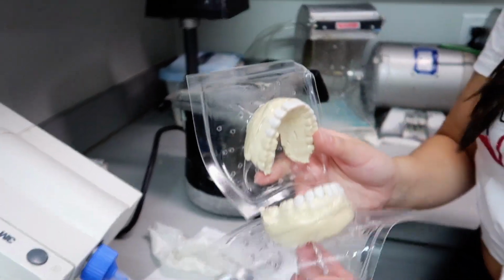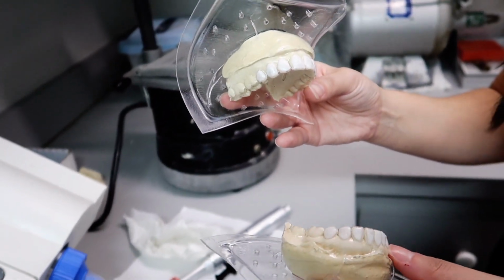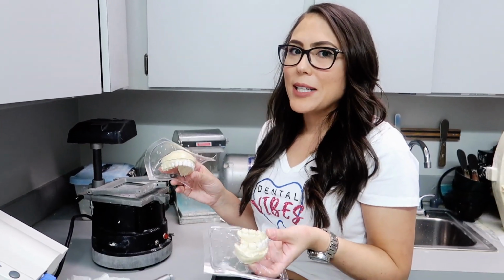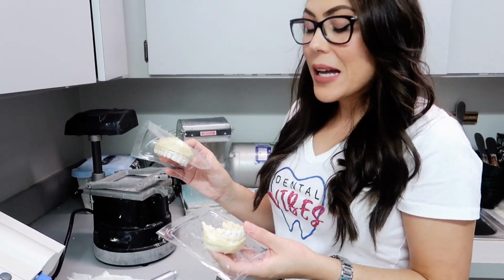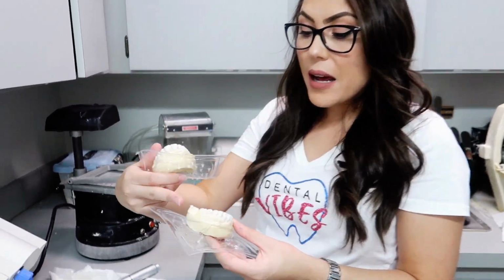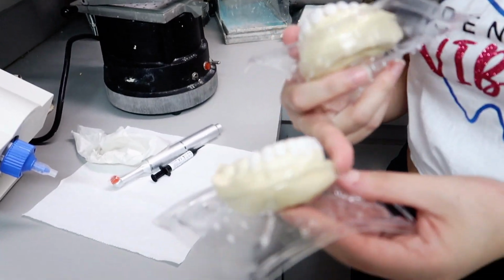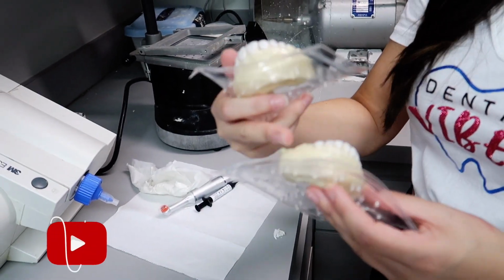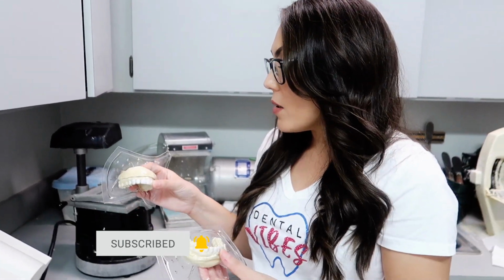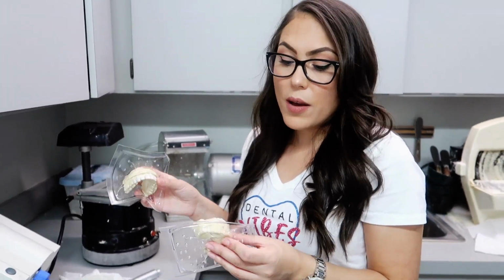There we have it. Mentioning again to check out our fail pouring video. Even though we had some issues with the pouring, the whole point of that video was to show you how you can pour without having to trim, so you can do bleaching trays. That way you see that the base of the model was not an issue that is going to prevent you from ripping this apart. That way you just save time and don't have to trim.